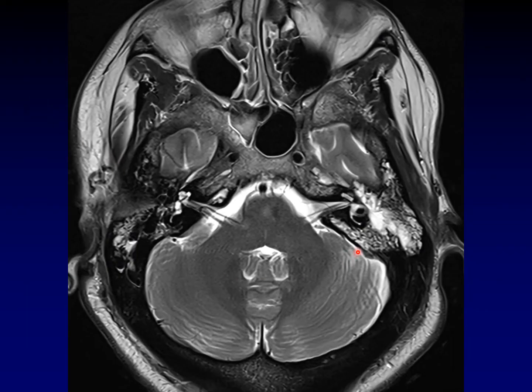Take this patient for example. There is abnormal T2 signal in the mastoid air cells bilaterally. Is this an effusion or is this actually mastoiditis? I'll give you a rule of thumb that doesn't work 100% of the time but is still pretty useful: if you see not only the mastoid air cells but also the middle ear cavity completely filled with fluid, that's probably mastoiditis.